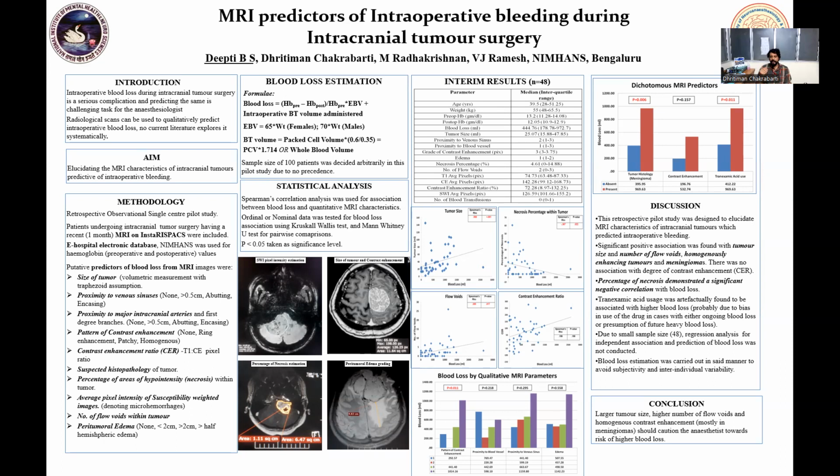That can happen in relatively less vascular tumors after radiation therapy. Okay, it can appear in poor grade gliomas, intra-axial tumors, which are poorer grade. Okay, because there is a lot of neovascularization happening, the blood-brain barrier is not intact, and because of that, it leaks out. Similarly, in good grade gliomas, it will usually not be contrast enhancing.